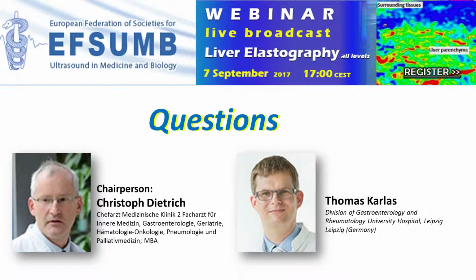So the clinical impact of the finding is limited in many cases. And for people with ascites without evidence of advanced fibrosis, I would be very careful when interpreting liver stiffness, because there's not much evidence what liver stiffness tells us in such patients.